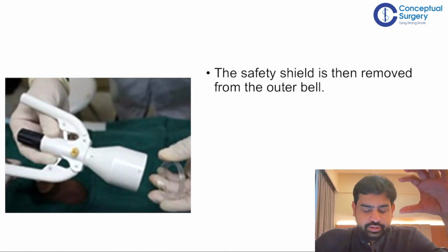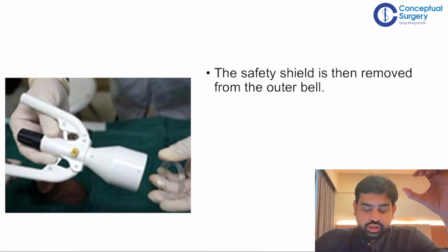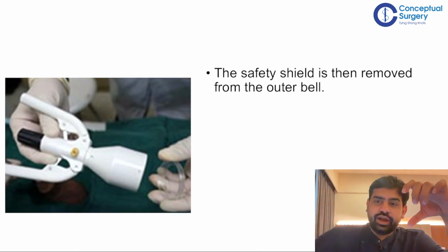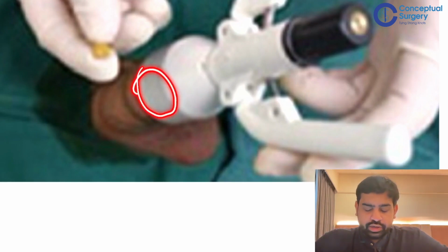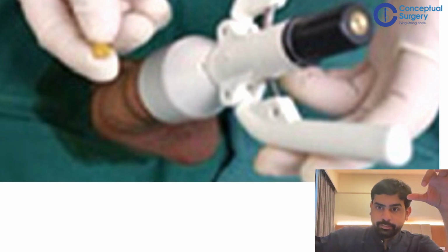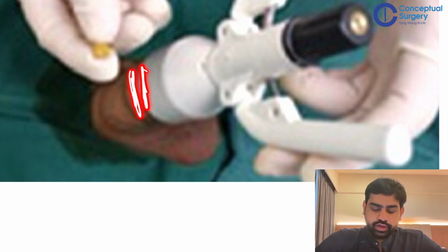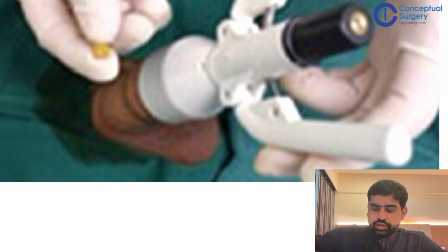Once you have removed the safety shield, you place the outer bell onto the middle of the inner bell. Are you understanding my point? The inner bell was at the coronal sulcus, and the prepuce was tied over here, and this was the middle, right? So you put your outer bell over that portion, and once it has reached the edge of the inner bell, now you have to tighten this. You can tighten this, or at this point, you can remove the safety cover.